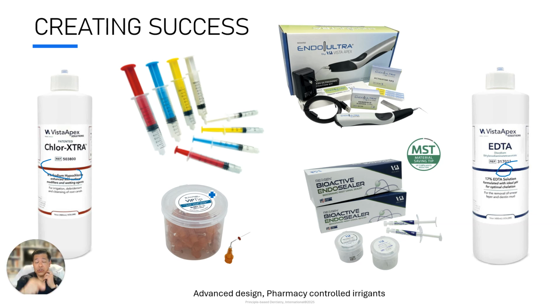I use the Endo Ultra, which has the ultrasonic activation inside of my irrigants, my Chlor Extra and my EDTA, to activate it, to clean out the canal even better. And then when I was done, we used a bioactive endo sealer, which is the bioceramic root canal sealer from Vista Apex. Now this is very affordable.